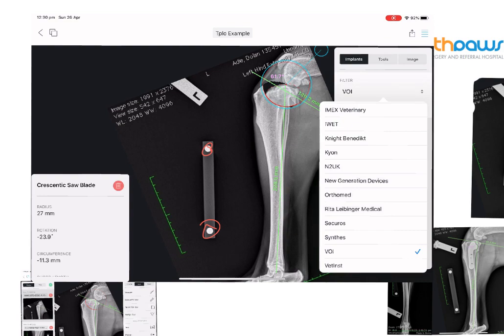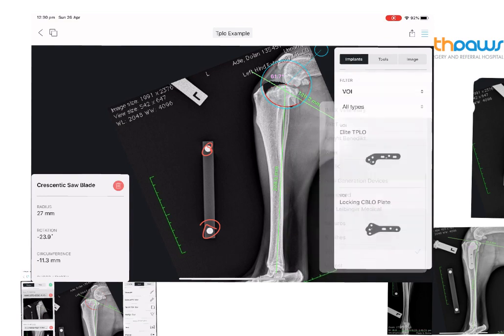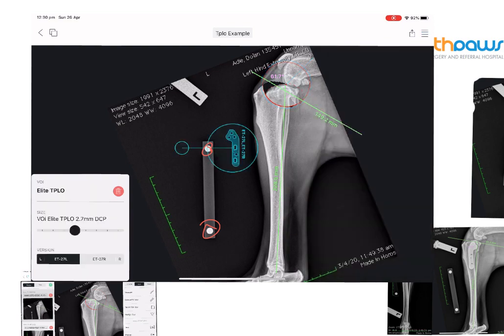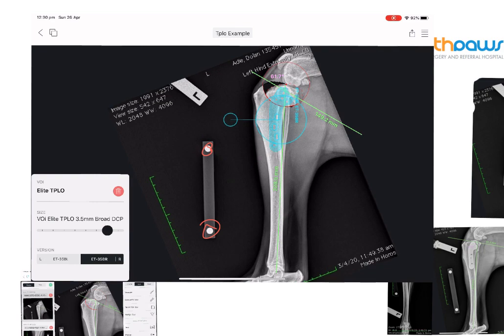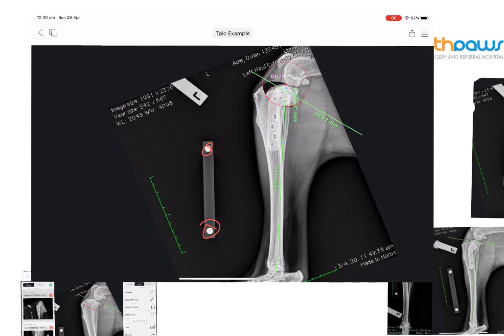We can then select an implant template to sit on the x-ray and choose different sizes — left and right. Here we're using a VOI plate, and we can select different sizes and move it over to make sure that we're going to have an adequate amount of bone stock in the proximal and distal segment to be able to get our plate in place.